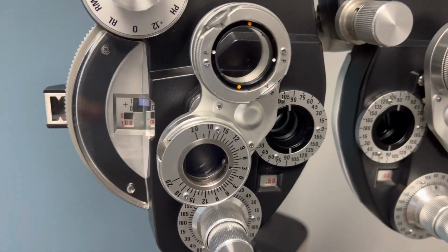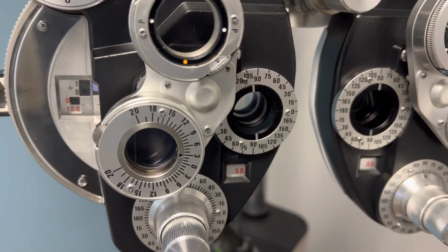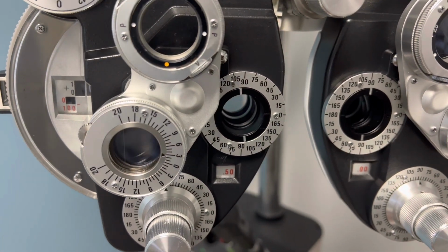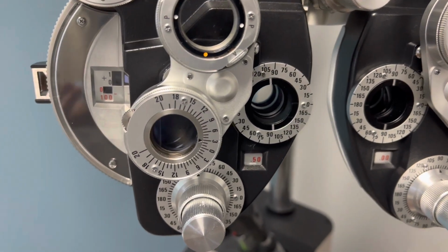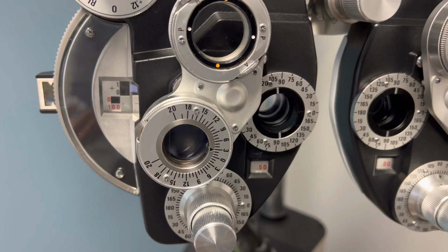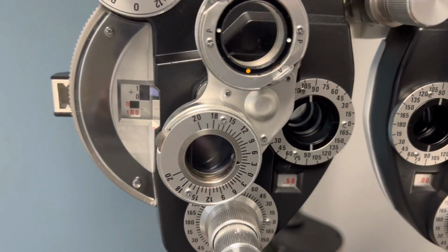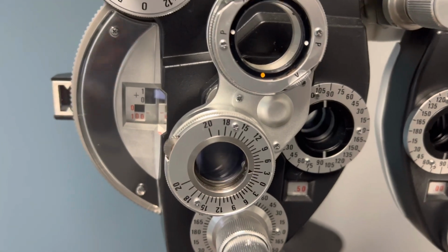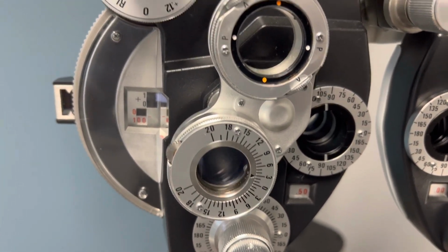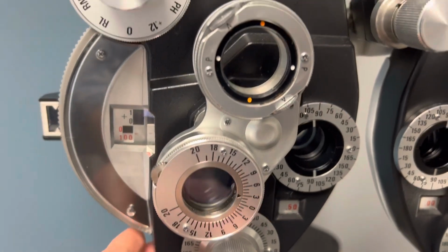So the next thing I'm going to do is put this prescription in, and I'm going to show you the eye chart, and I'm going to ask you to read the letters. And again, I expect you to see about 20/30 because that's what you were seeing out of your existing glasses before. So the next step is to give you a little bit of extra prescription to see if you can see that 20/20 line.